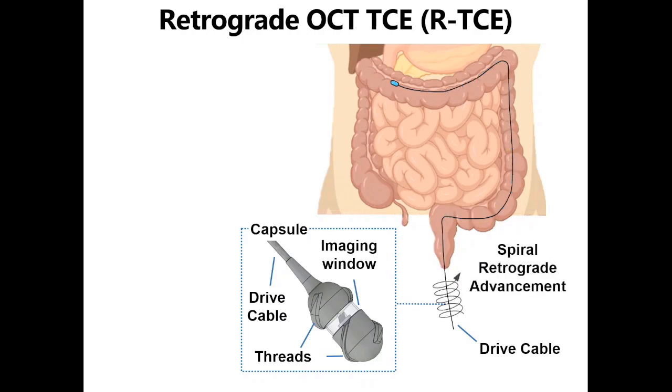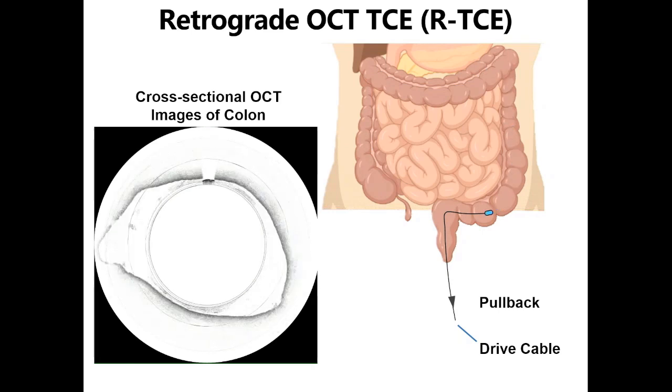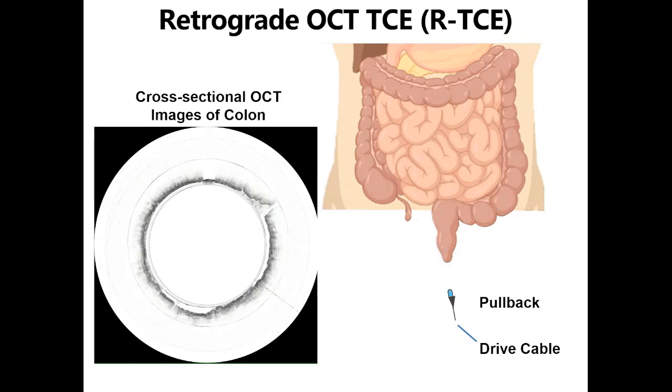Let's see if I can. Yeah, and then you can pull it back, and you grab images of the whole colon on the way back. And I see some of you in the audience making jokes.